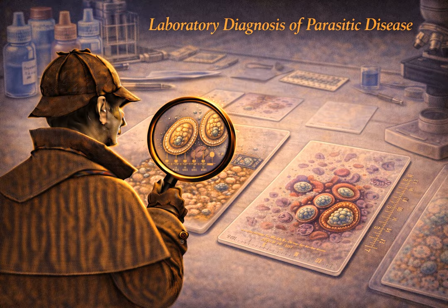Microscopy, for all its faults, casts a very wide net. You can see whatever happens to be swimming by. Antigen tests are a highly targeted sniper rifle. You only hit what you are aiming at.